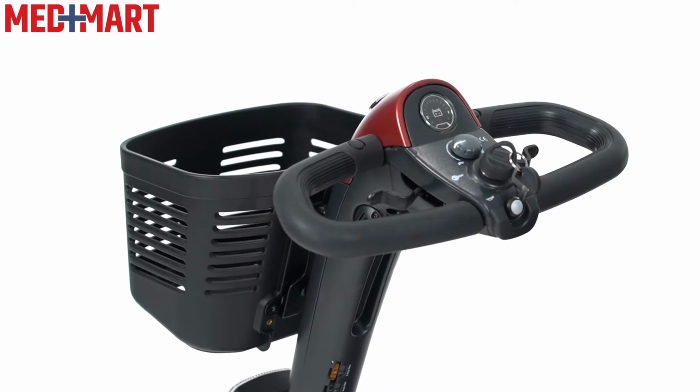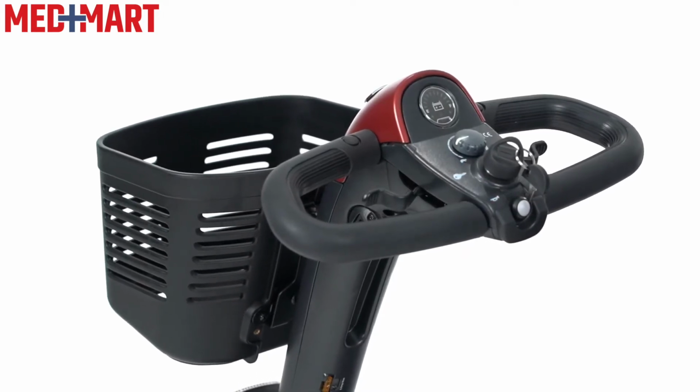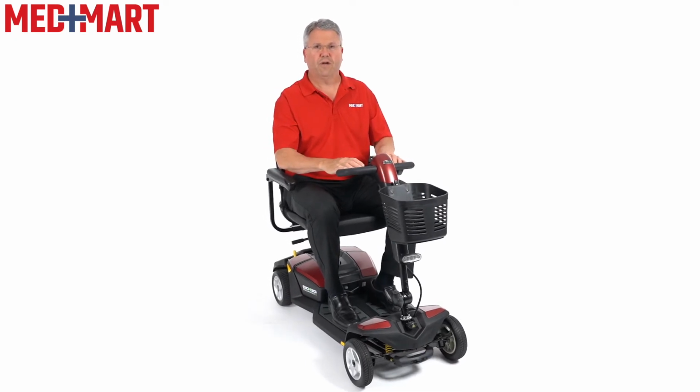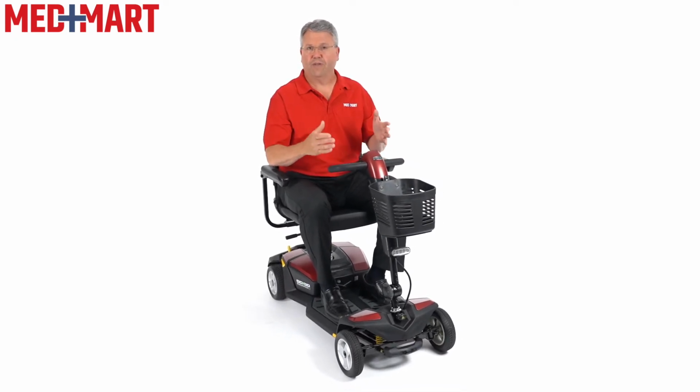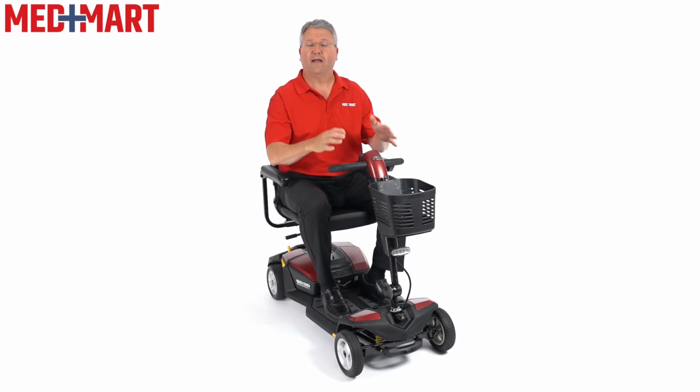Next we have what they call the Delta tiller, which is really just a fancy word for a wraparound steering wheel. And in here there are controls on either side which allow me to bring this scooter forward or back. The nice part about that is I can find a comfortable hand spot in the front or the back. It makes it easy to control with either the left hand or the right hand. That's also important if you have weakness on one side or the other a little bit, you can rest that hand here and control it with the left or the right side. So it makes it really easy to do that as well.